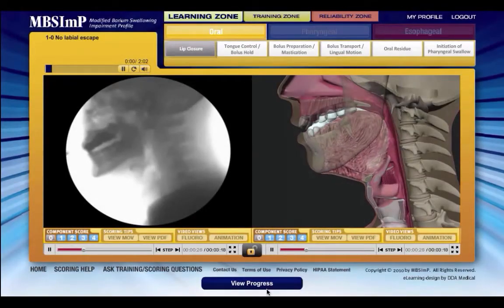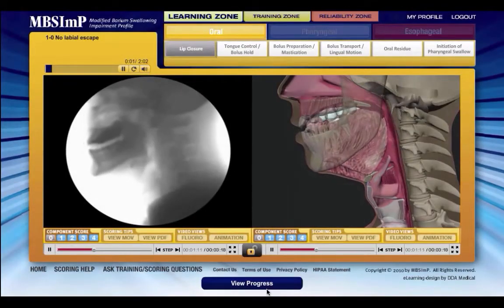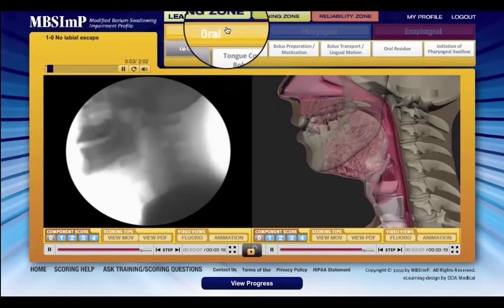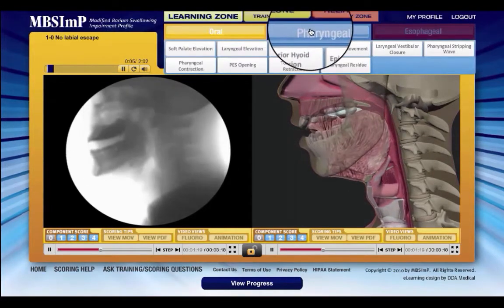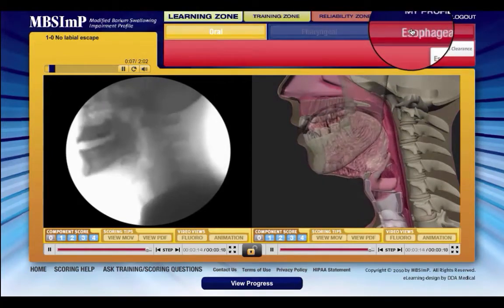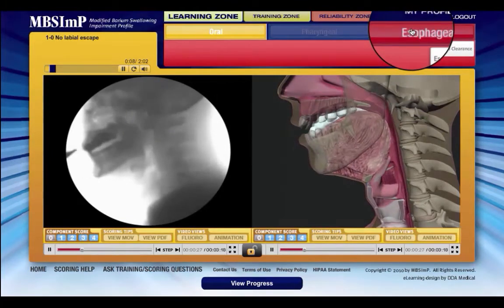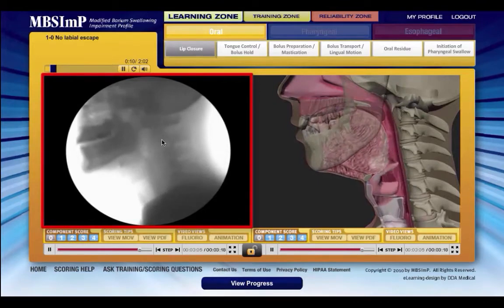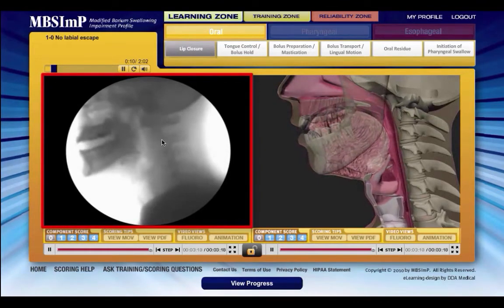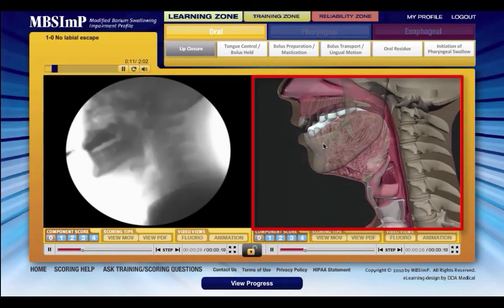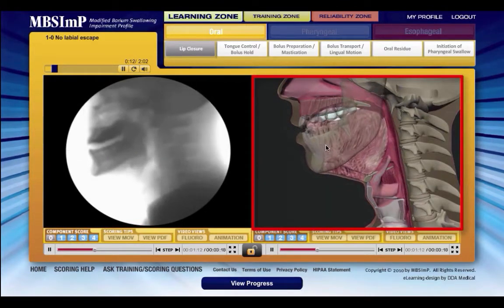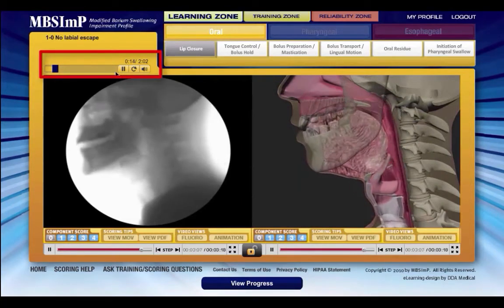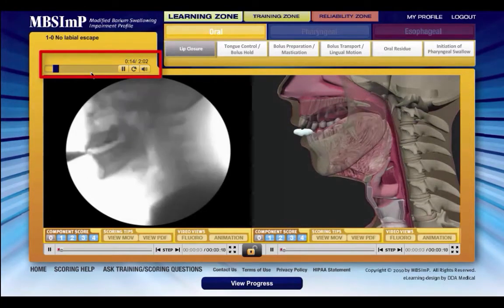Organized by three physiologic domains, the 17 MBS-IMP components are categorized under either the oral, pharyngeal, or esophageal domain. The scores for each component are explained and demonstrated using representative segments of video fluoroscopy paired with detailed and synchronized animation. Throughout the learning zone, audio provides additional information about the specific score being demonstrated.